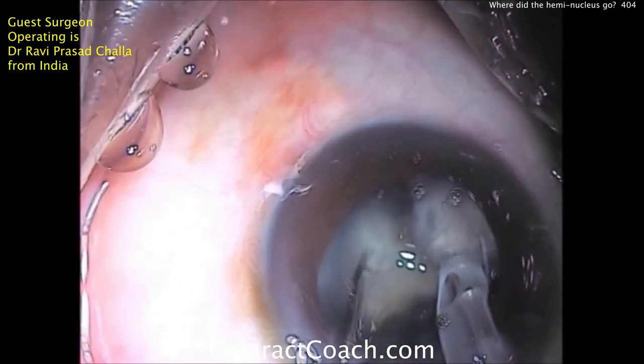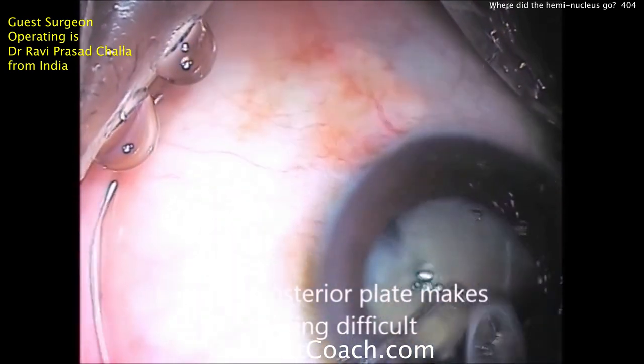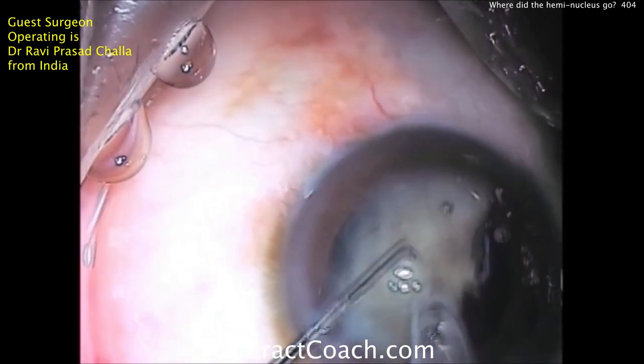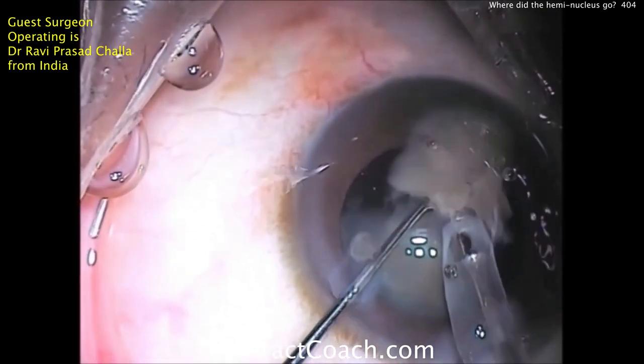So the surgeon, Dr. Challa, is going to phacoaspirate and remove and chop up the first heminucleus. He'll just take his time there. And again, the second heminucleus is still under the sub-incisional iris.